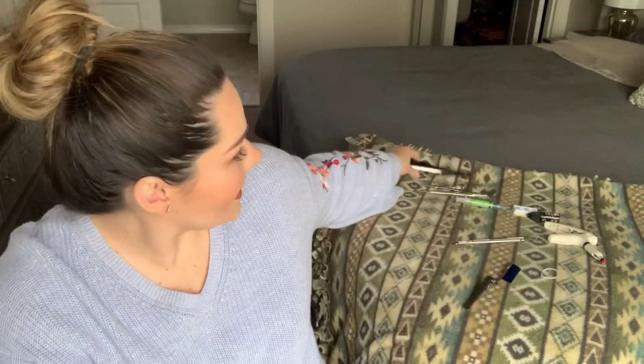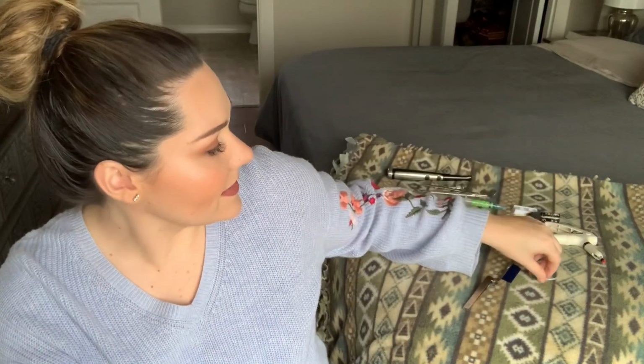And then when that's done, he will remove the matrix that he placed on the tooth. And then he will shape the tooth with his burrs. So you put your suction back in there. And then you're gonna wanna give the dentist floss.